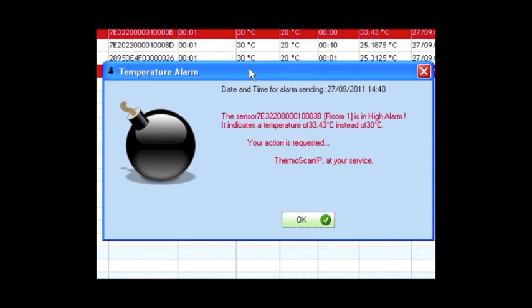In case of an alarm, you get such a pop-up. It gives the name of the sensor, the temperature threshold, and the recorded temperature.